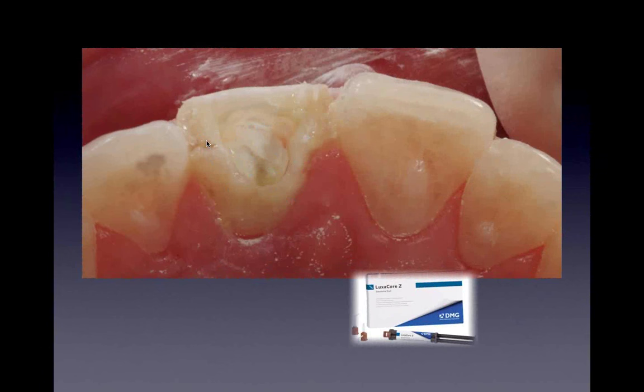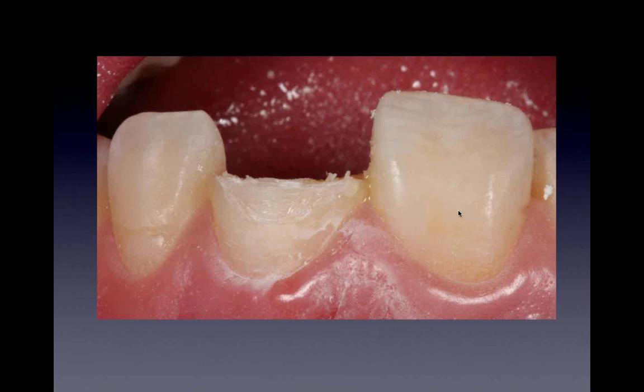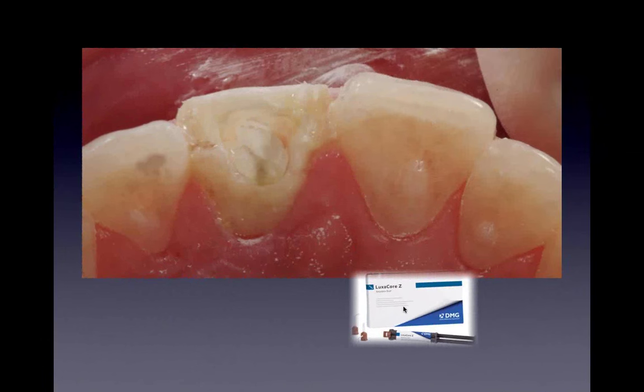I will do a full etch here, and we'll use the Luxacore as our base, and that usually has a shade of A3. So you can see from this photo, he's about an A2, bordering on A3, A2 with a little bit of A1 cervical lines here at the incisal. So he's a multi-shade A3, A2, A1. So if I see that, I know I'm going to put my base in, and that's my Luxacore.